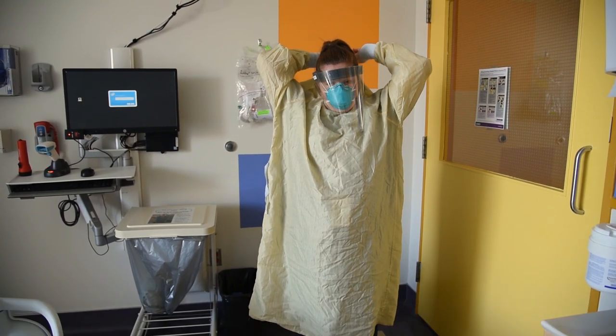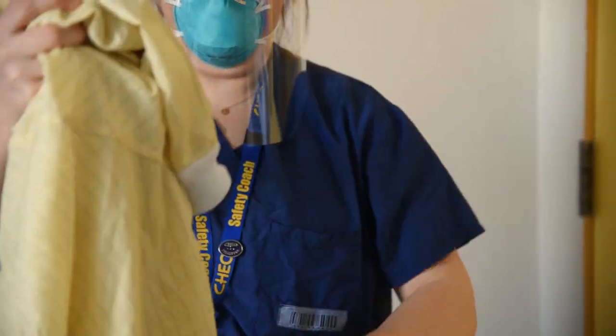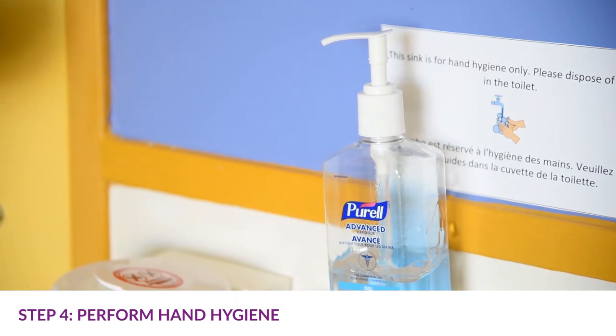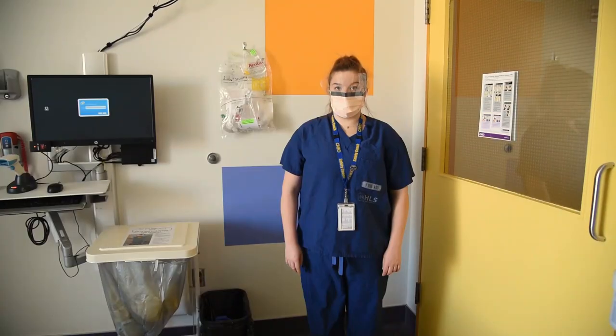Carefully unfasten the ties of the gown. Grasp the outside of the gown at the back of the shoulders and pull the gown down over the arms, turning the gown inside out during removal. Put it in the hamper, or if disposable, put it in the garbage. Perform hand hygiene.